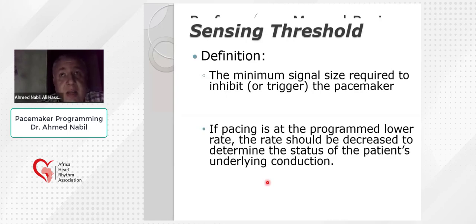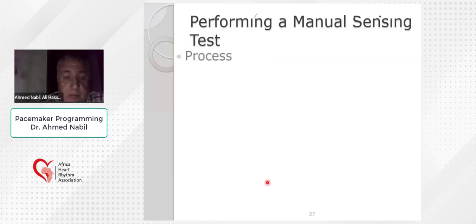I need the pacemaker to truly sense any intrinsic activity that occurs in the heart, so as to avoid unneeded or inappropriate pacing at the time in which there is an intrinsic activity. So sensing is very important, and the importance increases in the presence of intrinsic activity.